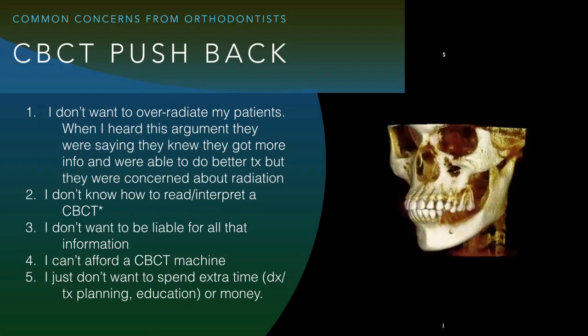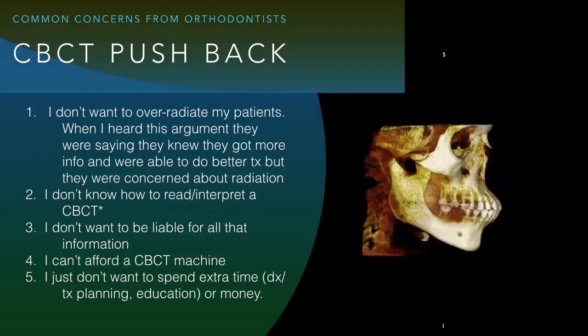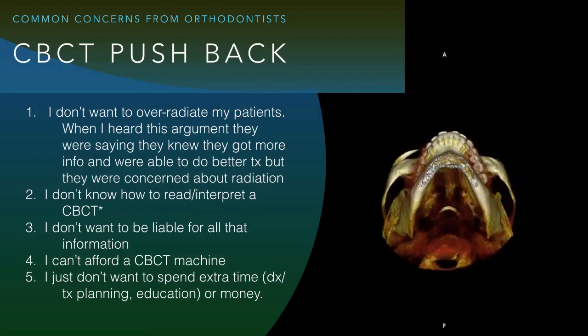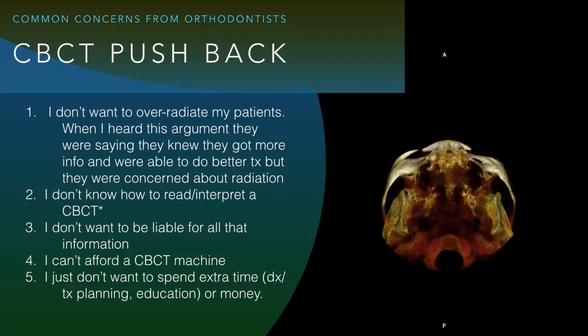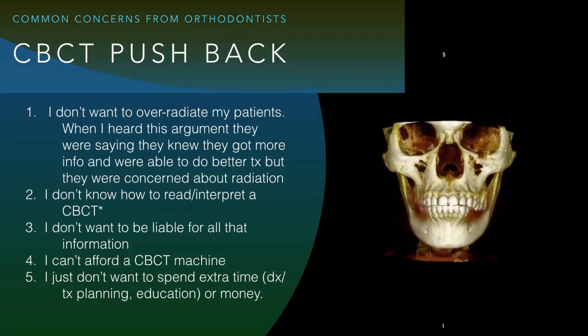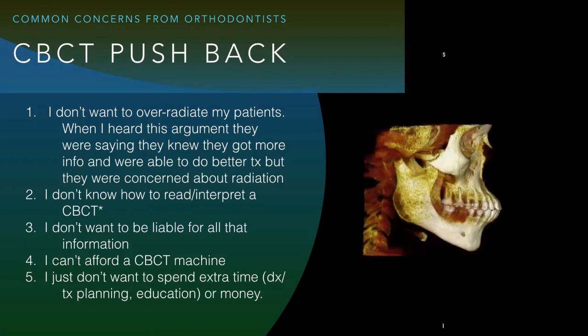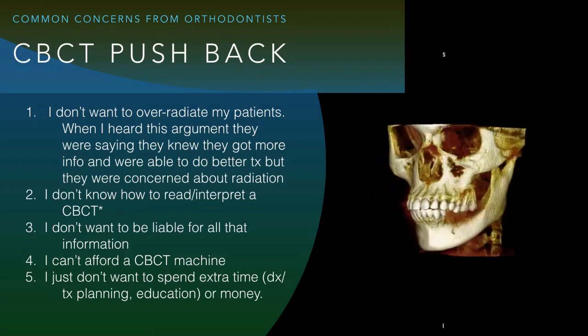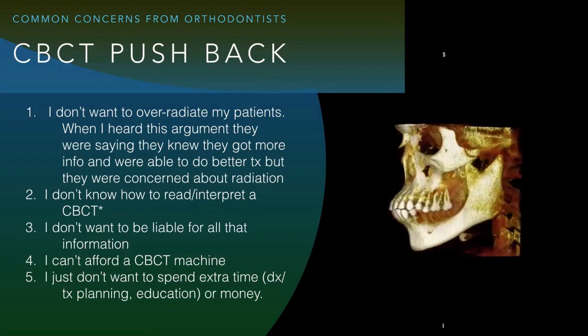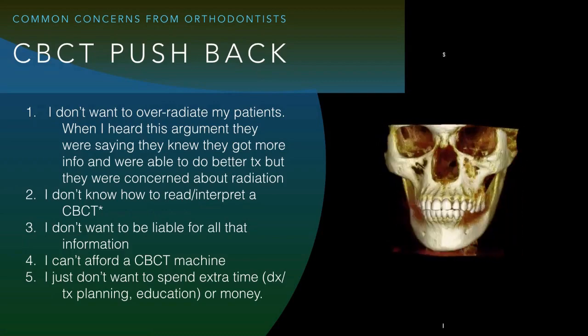We were told in one of our legal classes in residency, it's not a matter of will you be sued, it's a matter of when. And I think CBCT and the amount of information that I have before me allows me to do a better job with diagnostics. So you're going to be liable for the information, whether you want to be or not. And that's really whether you refer out to a radiologist or not as well. You're still responsible for the orthodontic component of the treatment.